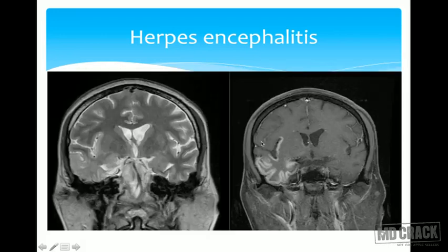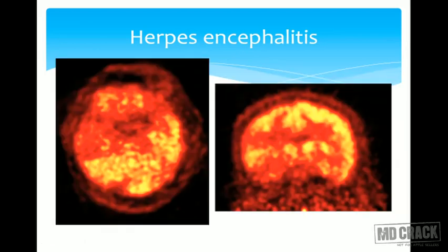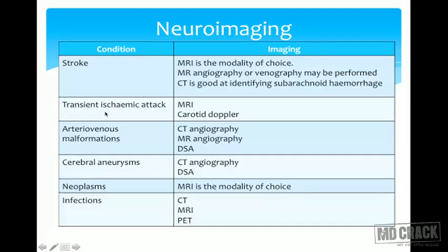In herpes encephalitis, a gradient echo image rules out hemorrhage within the involved area. On T2-weighted imaging, the lesion is barely visible, but post-contrast imaging increases confidence in identifying the involved area. After MRI, a lumbar puncture is performed. The same patient underwent a radionuclide scan, which showed hypometabolism in the area involved by herpes encephalitis.